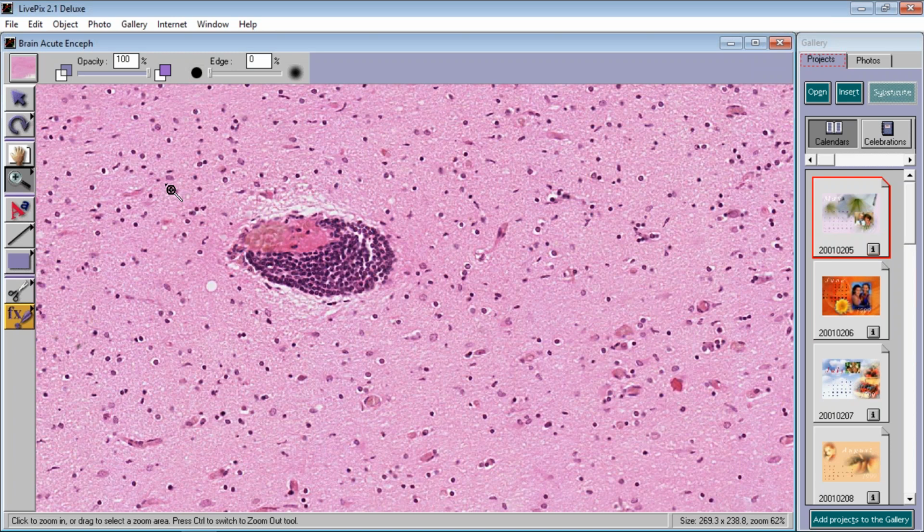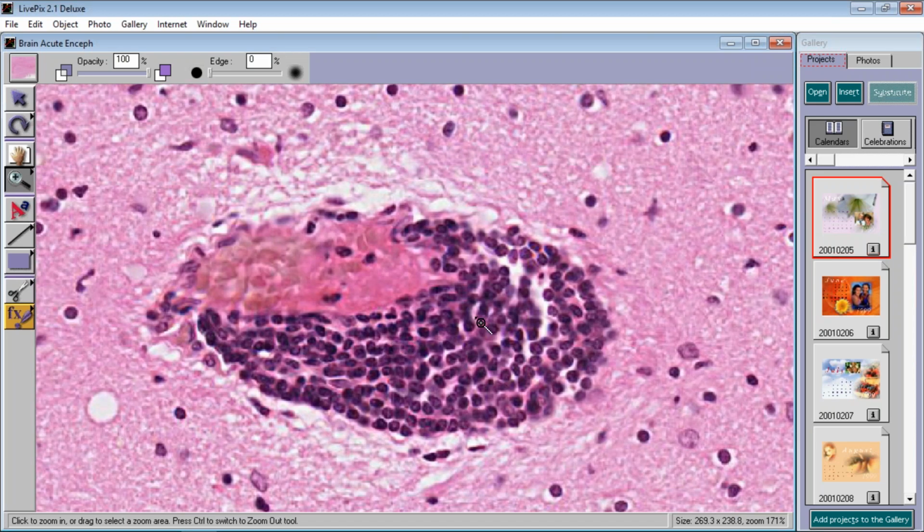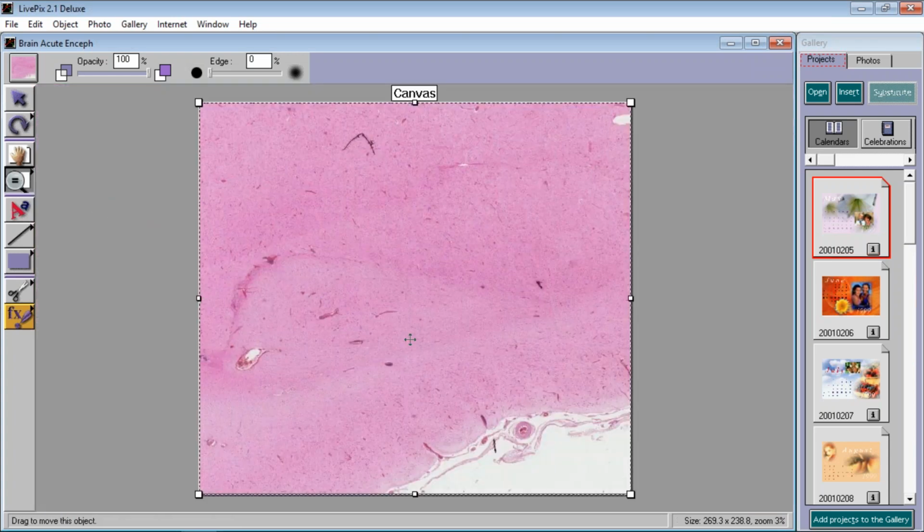Now, that's a very, very important point, because if you're only a pathologist and you see neutrophils, you call it acute, and if you see lymphocytes, you call it chronic. But in this case, even though we're seeing lymphocytes, we're calling it acute. This is not acute pathologically, this is acute clinically, which means the patients may have developed it quickly over the period of a couple of days even. Now, as a rule of thumb, even though we haven't gotten to the central nervous system yet, I want to tell you a very big principle here. Most meningitis are bacterial, and most encephalitis are viral. And there's a good number of exceptions to that, but that's a general rule.